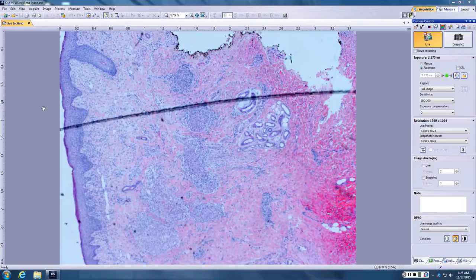Partially clad. But sarcoidal granulomas really shouldn't have the lymphs. If the lymphs are there, then it's not truly a naked granuloma. And these are partially dressed granulomas. So we better go down the differential of both naked granulomas and non-naked granulomas. Because these are partially clothed, if we say the naked granuloma differential, what's the differential for naked granulomas?